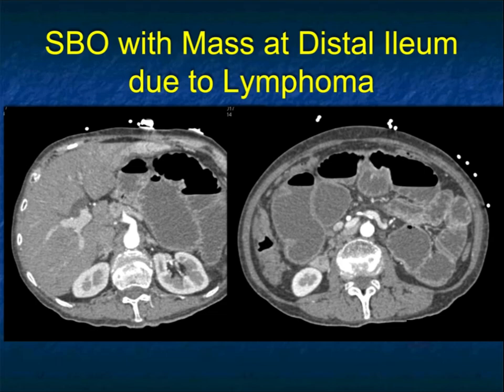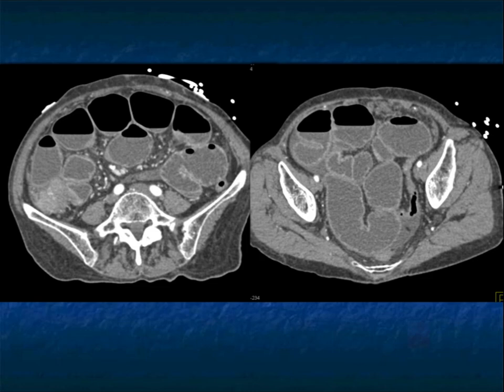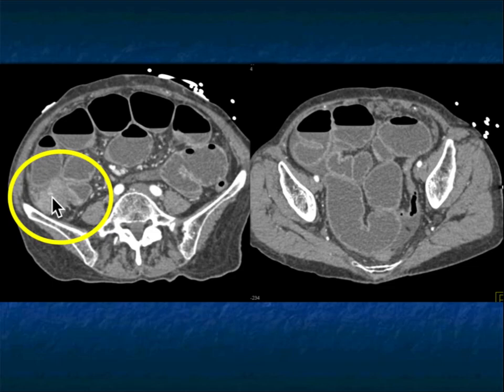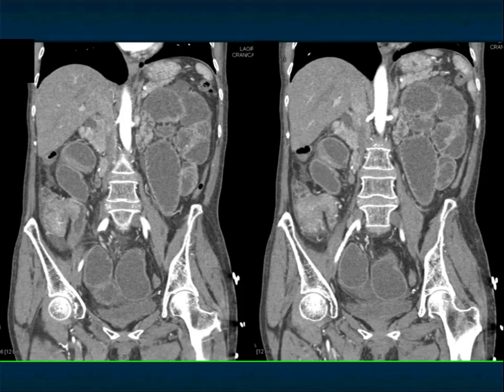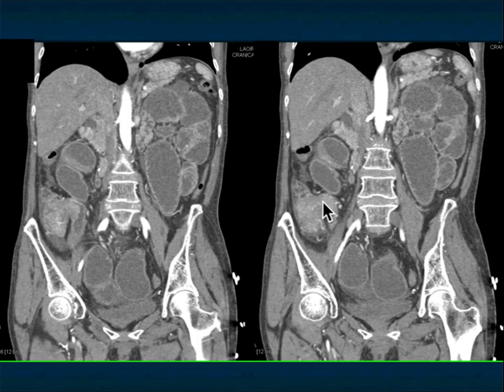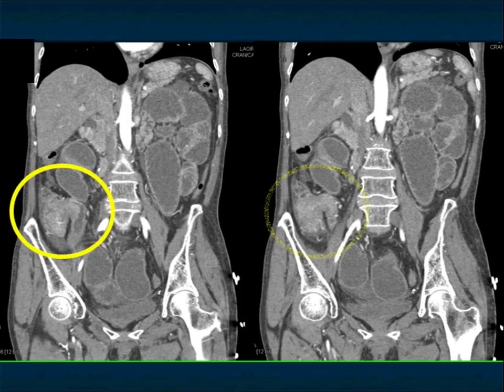Small bowel lymphoma can cause obstruction. Here's a patient with dilated small bowel loops. We track it downward and see the transition is at the level of the distal ileum and the level of the cecum, where there's a soft tissue mass present. You might think it's an adenocarcinoma of the cecum growing into the small bowel, but usually it's small bowel growing into the patient's colon. That appearance is very good for lymphoma. This was a B-cell lymphoma involving the terminal ileum extending into the patient's cecum.